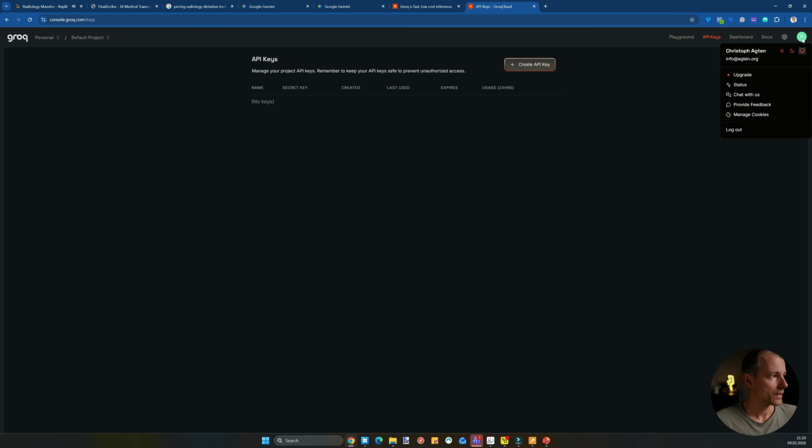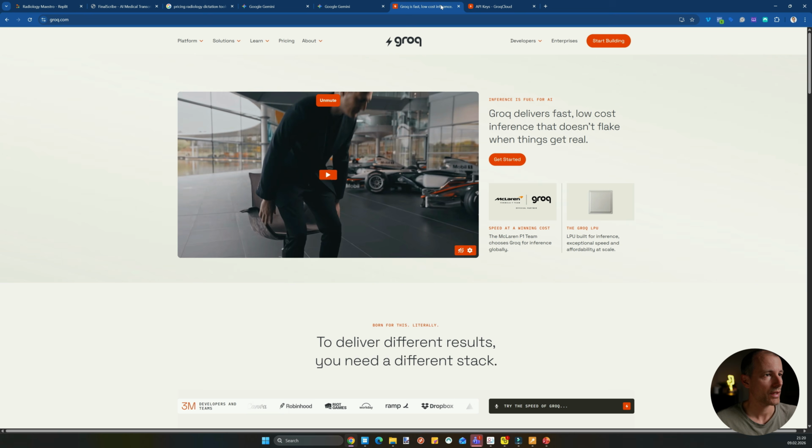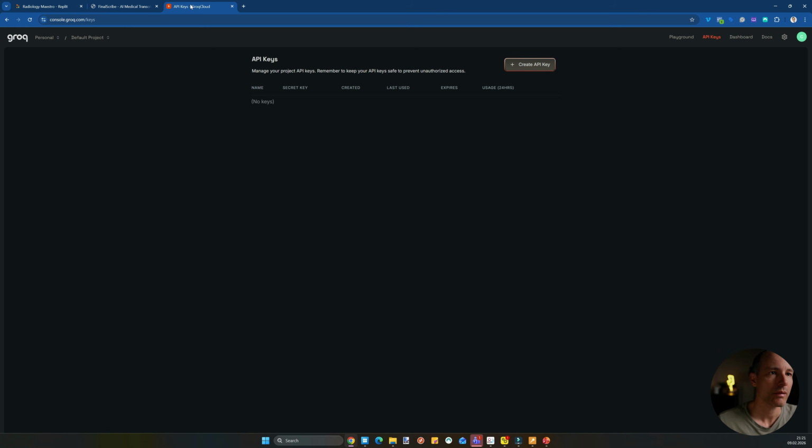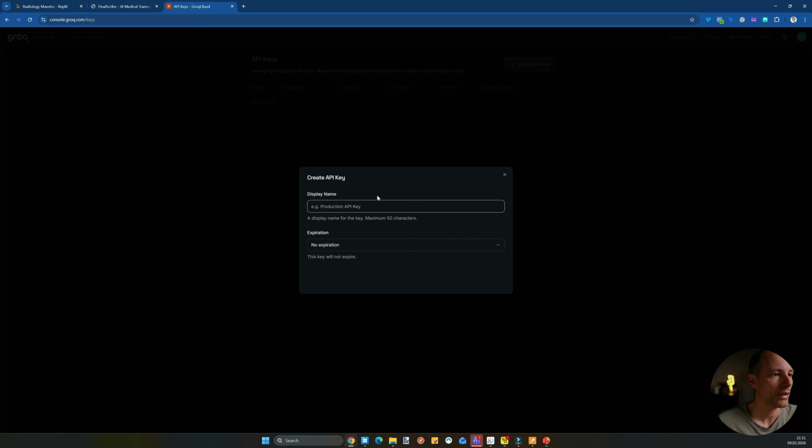Go to API keys. I'm already logged in. So here we will have to create an API key. I'll show you this later, but if you have time, you can already make the account in the meantime. It's now asking for the OpenAI key. I'm going to do this now, create API key. Let's name it Final Scribe 2.0, no expiration.